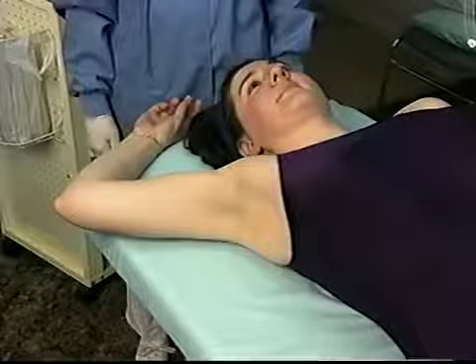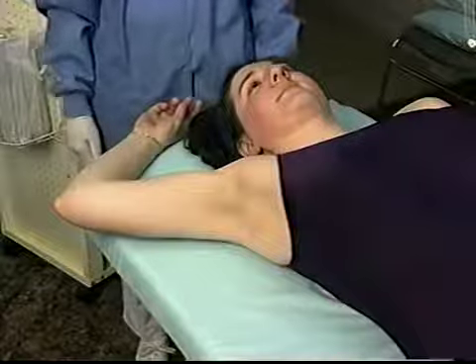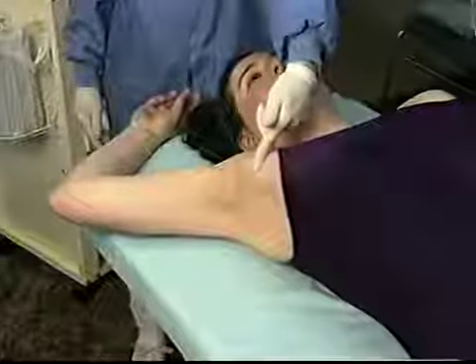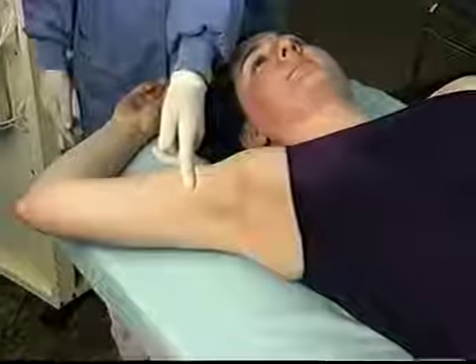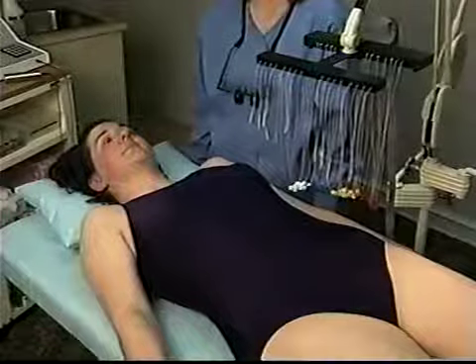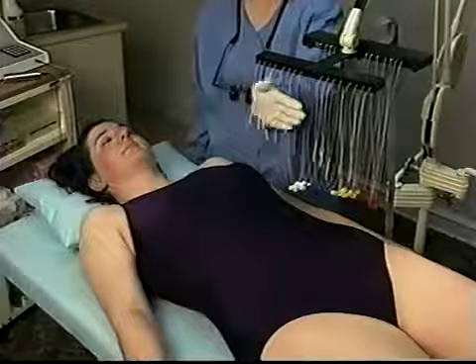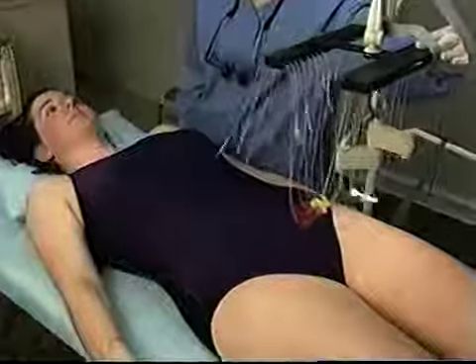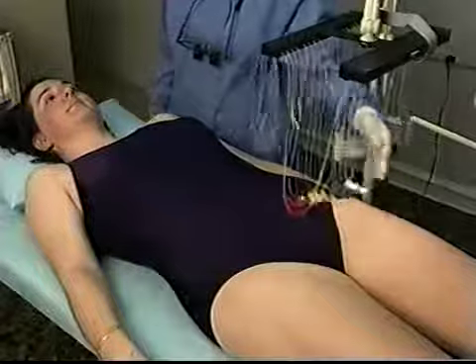I don't try to do the entire axilla all at one time, but I divide the area. I work from one end to the center, and then I reverse it and work from the other end to the center. For the abdomen, align the needles over the center of the body. For the pubes, it may be convenient to rotate the rack so the back is over the thighs.